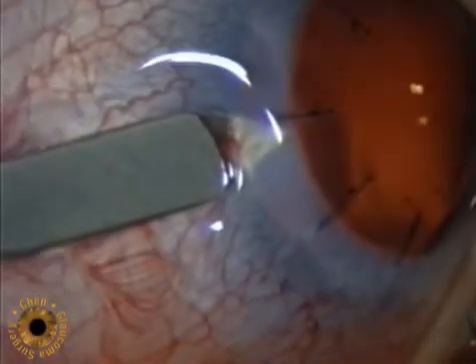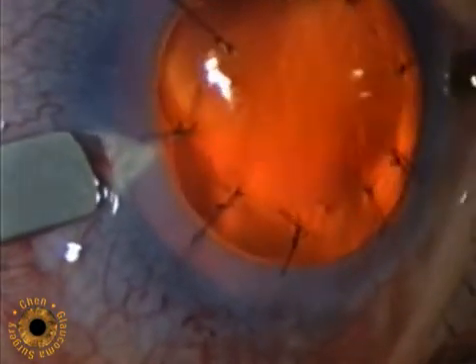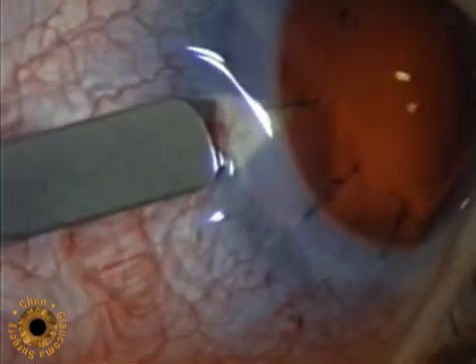In this eye that has had a prior corneal transplant, the entry wound for the ECP probe is being created using a 2.5 mm steel keratome through the surgical limbus.